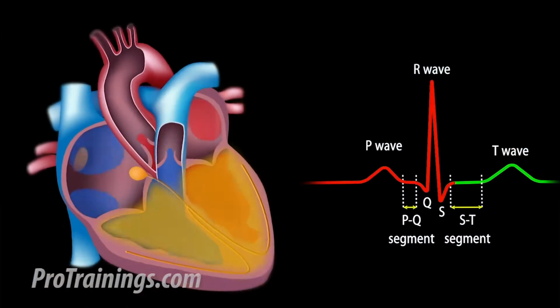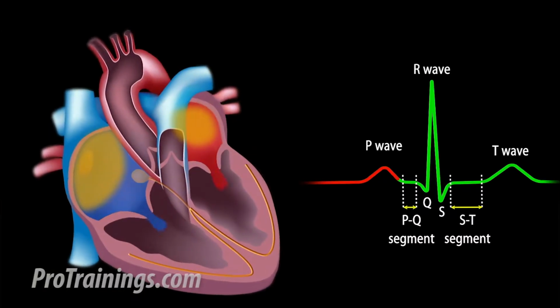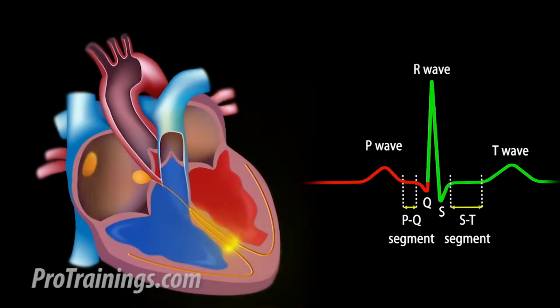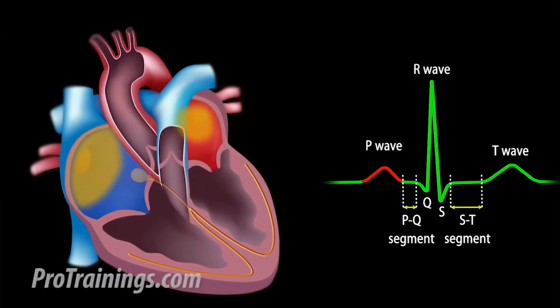An ECG waveform represents each electrical event in the cardiac conduction system during a cardiac cycle. This doesn't mean necessarily that the muscle is reacting correctly or in correlation with the electrical patterns, but simply shows that the electrical events that may stimulate myocardial function are happening. This will be discussed in more detail when we look at each rhythm individually. Now, for the following explanation, we're going to be evaluating a normal waveform and assume that normal mechanical function is occurring.